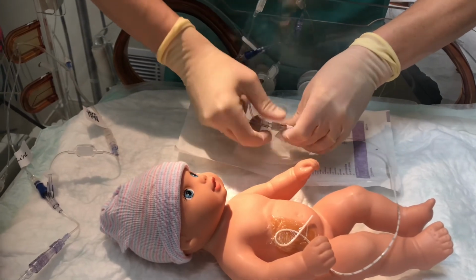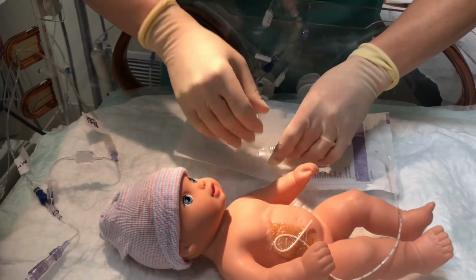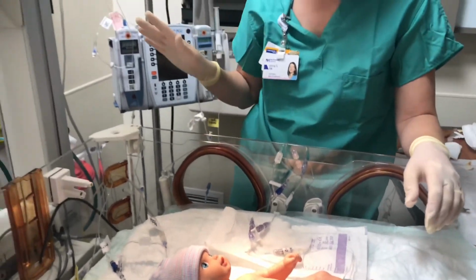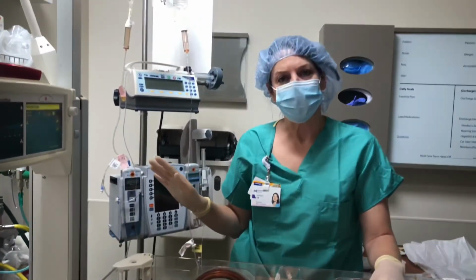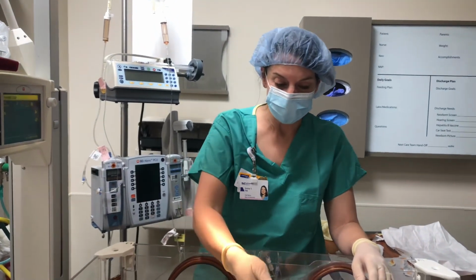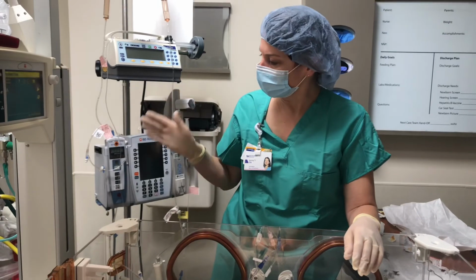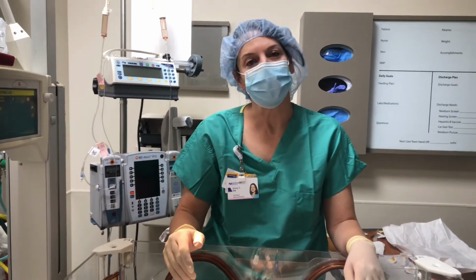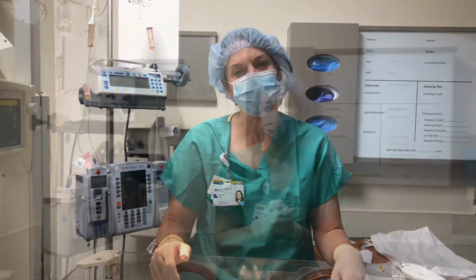Okay, and now we're complete. And now we can take our old tubings out, put our new tubings in the pump, again verifying with that second RN, tracing our fluids from site of origin up to the pump, verifying our rates, and at this time we would be done with our central line tubing change.